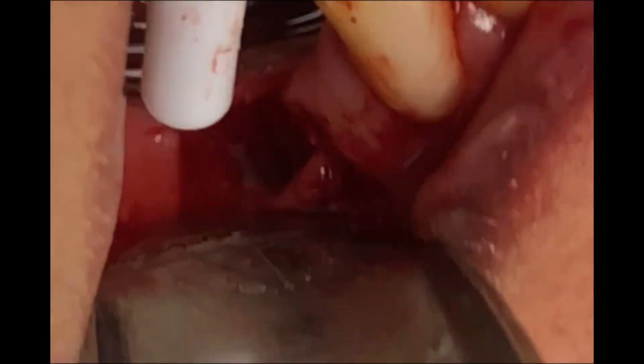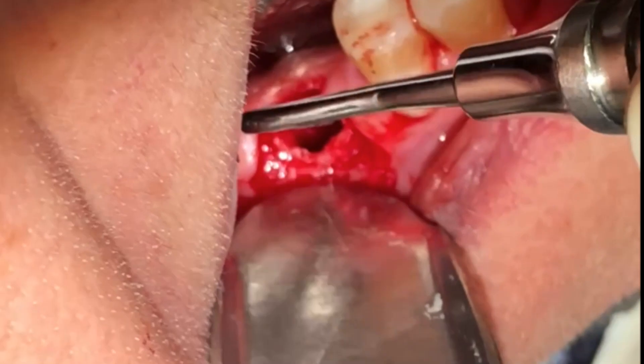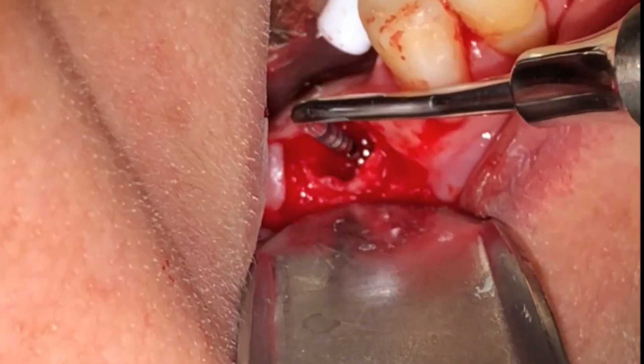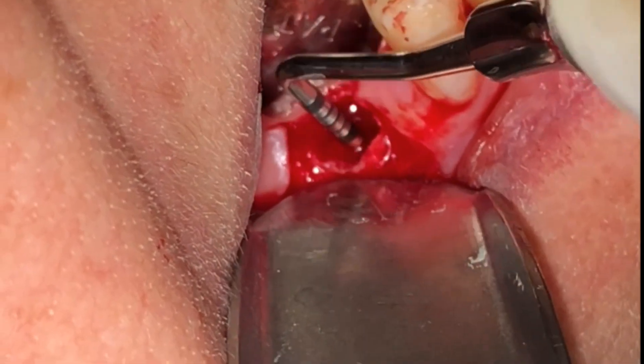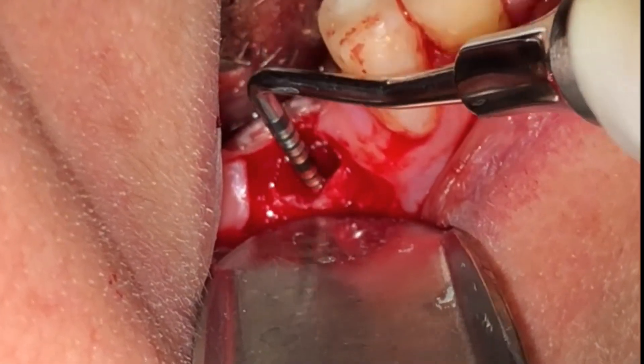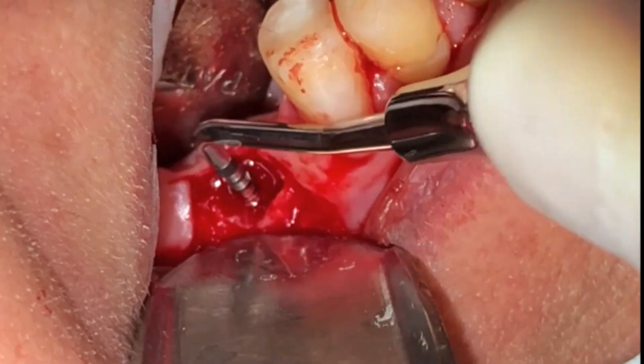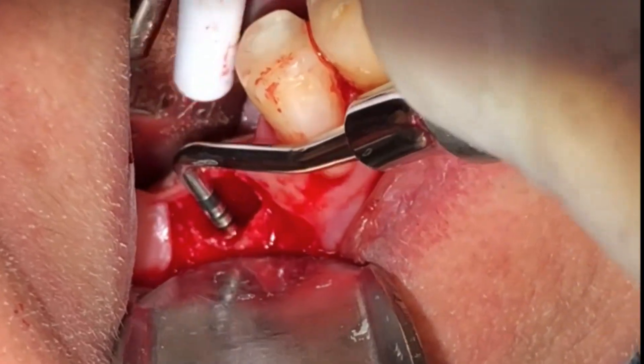Irrigation with ozonated sterile saline. I like to feel around and sound the bone along the osteotomy internal surfaces to make sure I am fully inside bone and that there are no perforations.